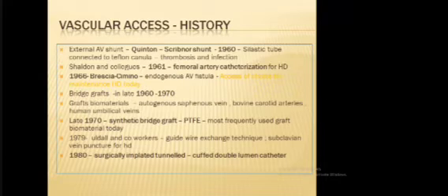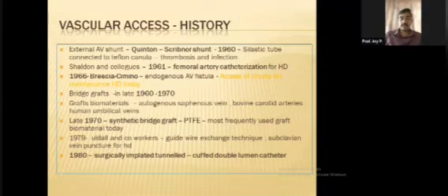There are a lot of other things. I'm not going into details like grafts, AV grafts, synthetic bridge grafts and tunneled catheters. Newly, that is a recent advance, like the double lumen tunneled catheter and all this.